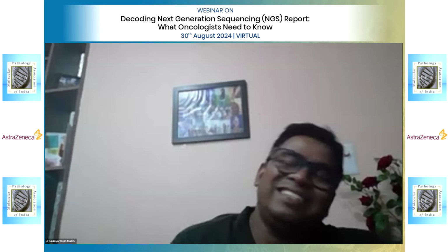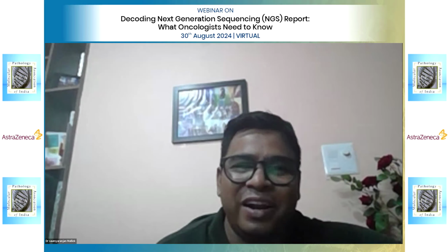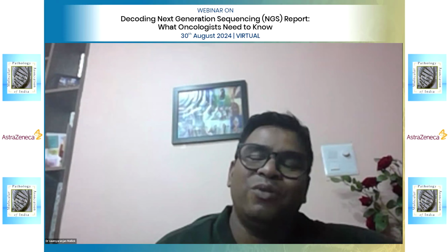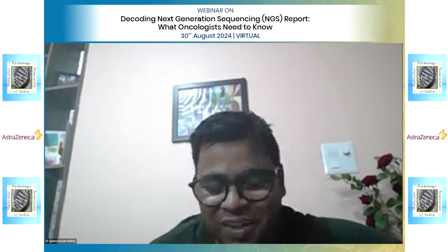Just clarifying a little bit, the result will always be different, because the VAF will differ depending upon the tumor content. So it will be difficult to interpret. Apart from tumor heterogeneity, even in the same tumor, if somebody has more and somebody has less tumor content, it might be difficult to get the VAF.